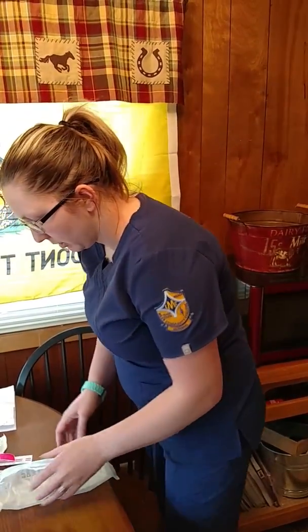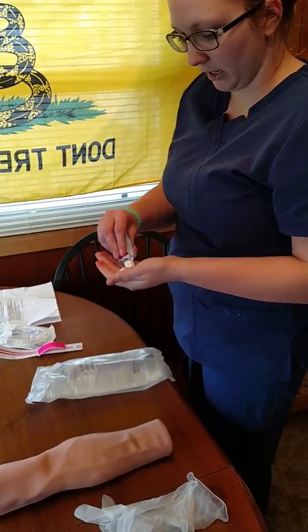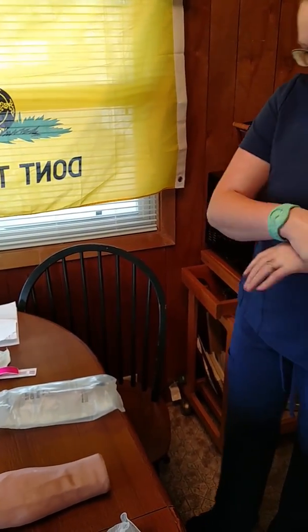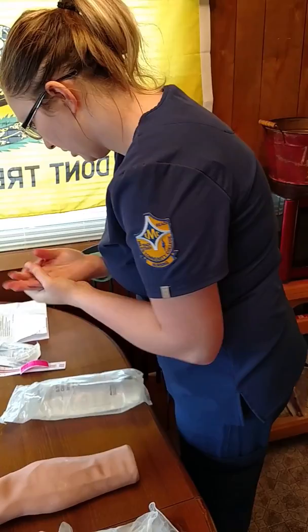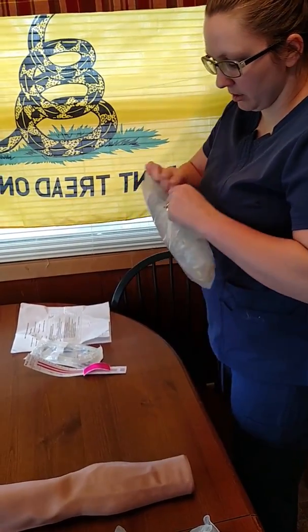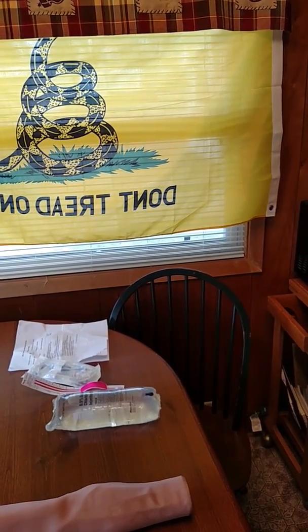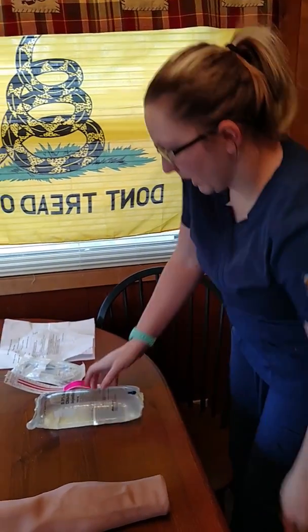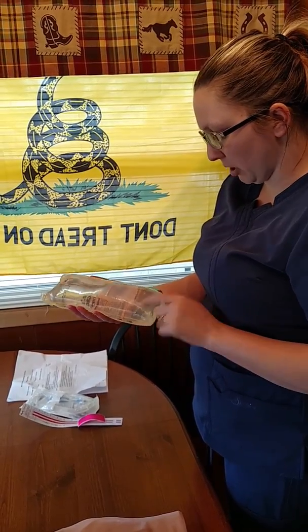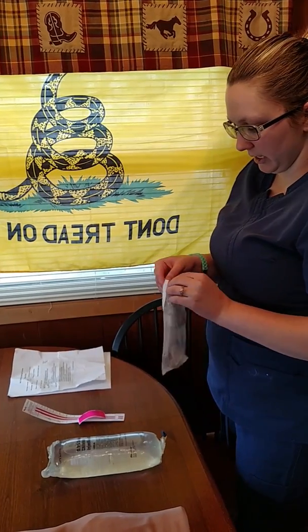Once I get this set up, I'm going to go ahead and just wash my hands here real quick and then get my IV set up before I head to the patient's room. And I'm just going to check my bag, make sure that there's no leaks, no cracks, that there's no particles hanging in it. And we'll go ahead and get started setting it up.